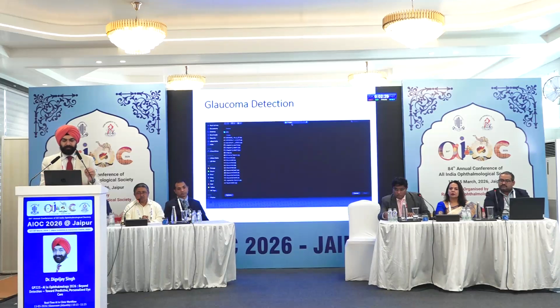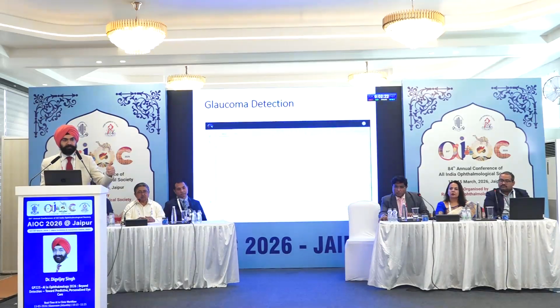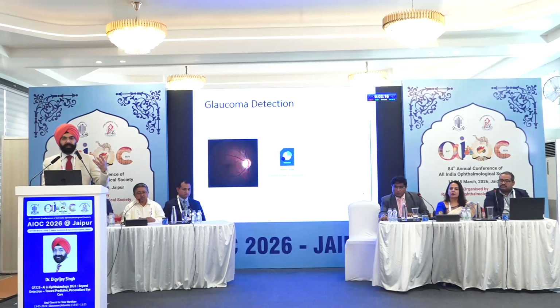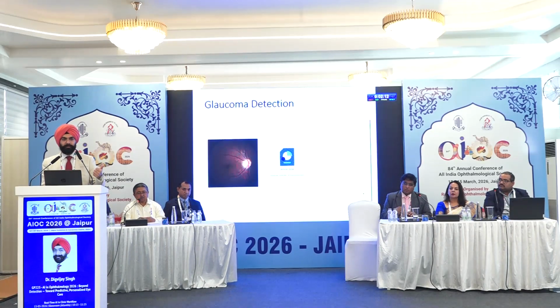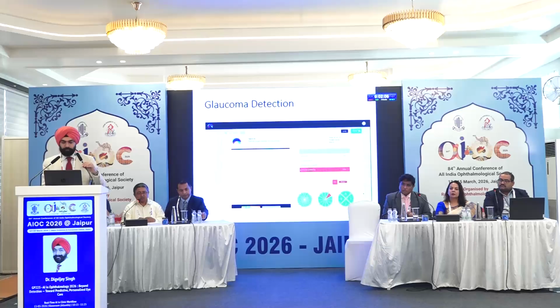This is the most simple form that I developed some time ago, where all we're doing is taking a single picture of the fundus, and we analyze that on a cloud to see what is the change that is happening on the optic nerve head. We score this using the DDLS scoring, or the disc damage likelihood scale. As it is scoring, it's going to process and tell you the risk and likelihood of glaucoma.